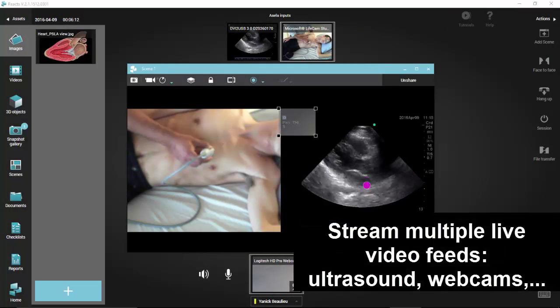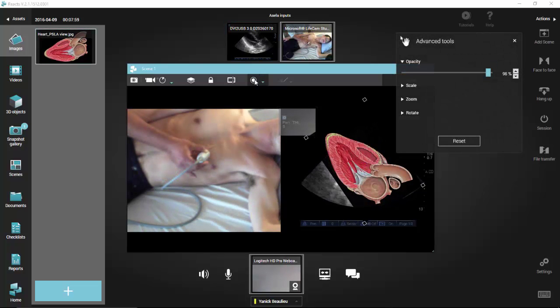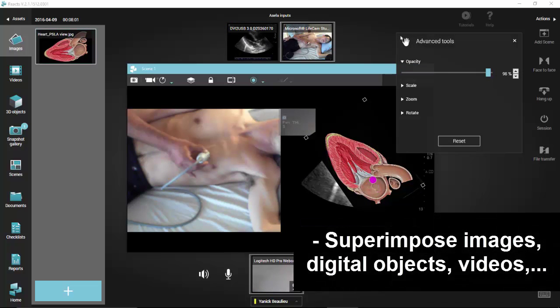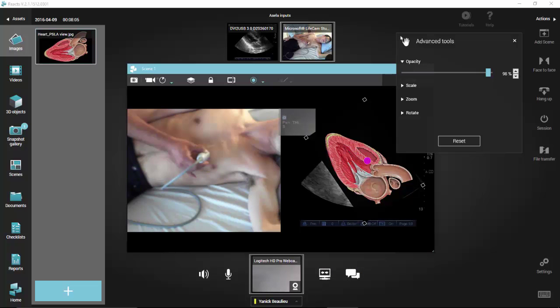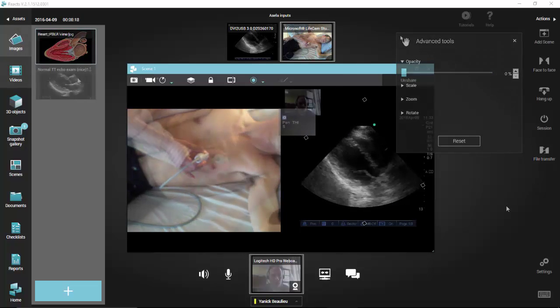Now, what is this structure here? So that should be the left atrium. Okay, excellent. That's exactly what you described: the left atrium, the two leaflets of the mitral valve, the posterior wall of the left ventricle, the anterior wall, the RV, the two leaflets of the aortic valve, and the ascending aorta. So you've shown that very well. So here you go. This is a very nice anatomy.